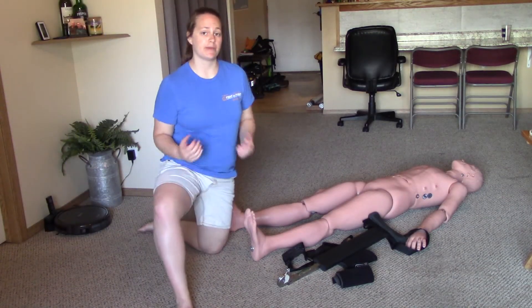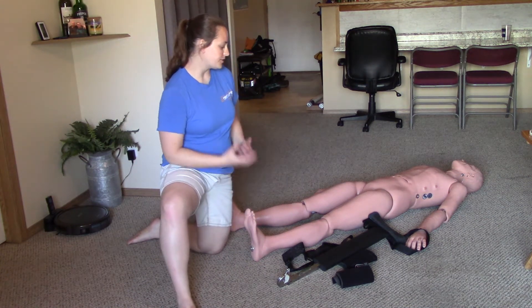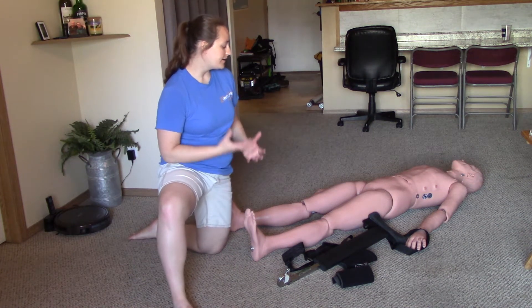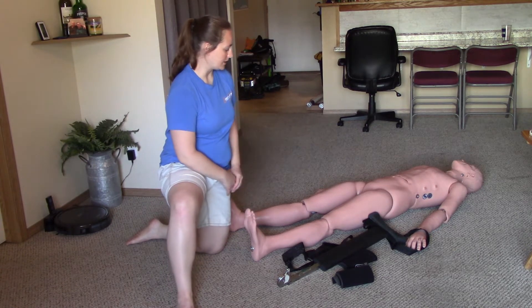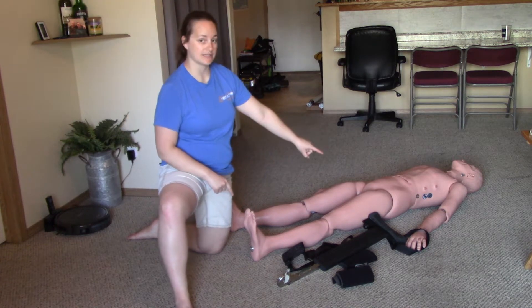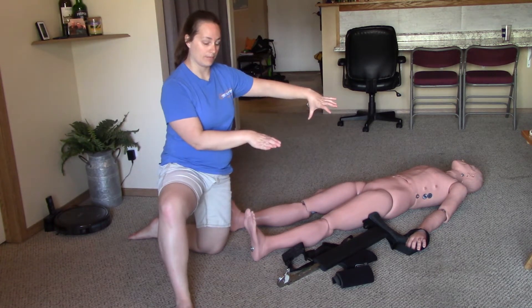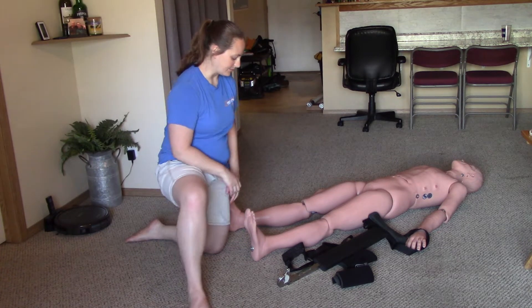For the traction splinting station, you'll be informed that you're applying a traction splint to a patient with an isolated mid-shaft femur fracture — in this case, on the patient's left leg. I have my PPE on. I'm going to have my partner stabilize the injury, applying stabilization above and below the injury, and I will check CSMs.